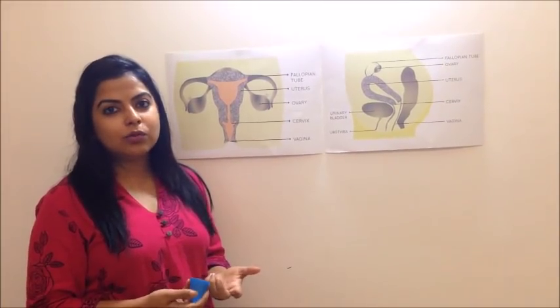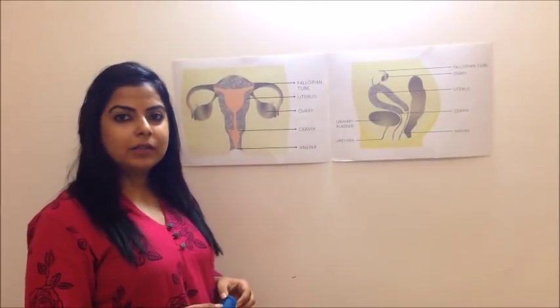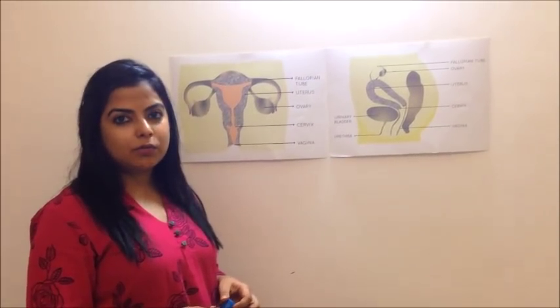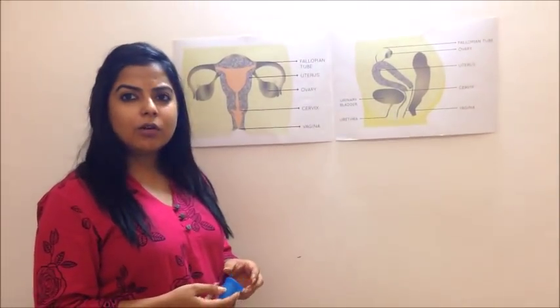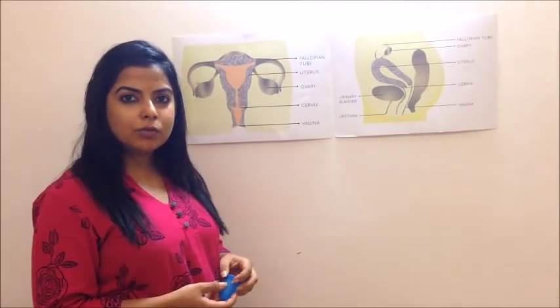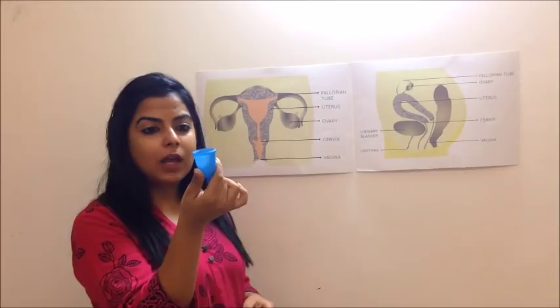Menstrual cups are made of medical grade materials, so it's totally safe to be worn internally in the body. Medical grade silicone is very similar to the material used for making baby bottle nipples, so it's a very soft material. Sometimes people get scared — it looks really big and huge, how am I supposed to insert that — but it's soft.